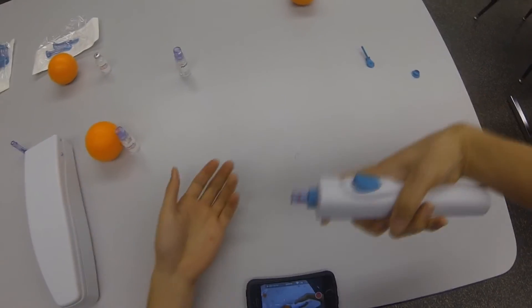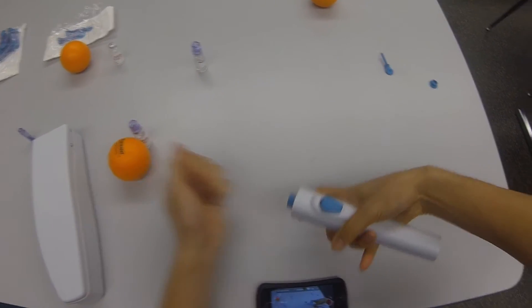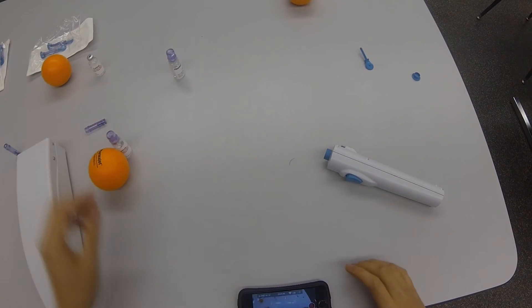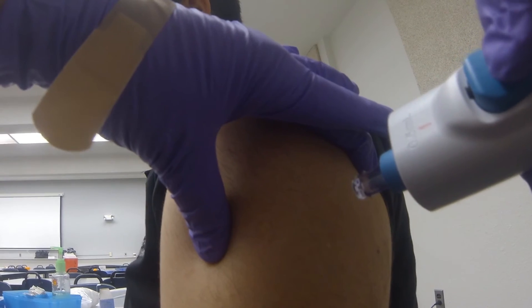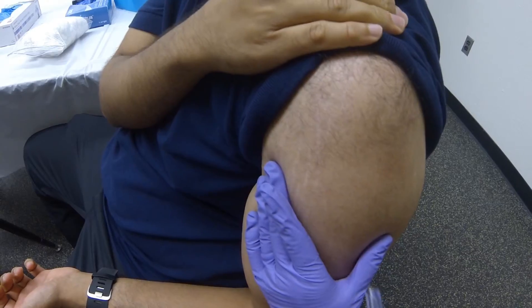Press the bottom button to discard the used syringe dose into the trash or whatever container your institution specifies. Thank you.